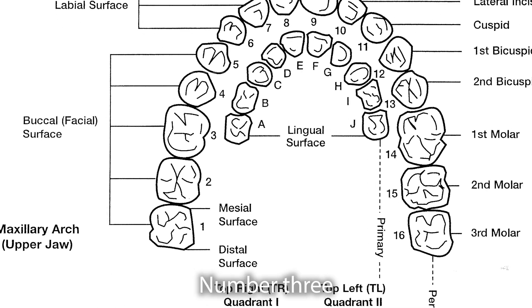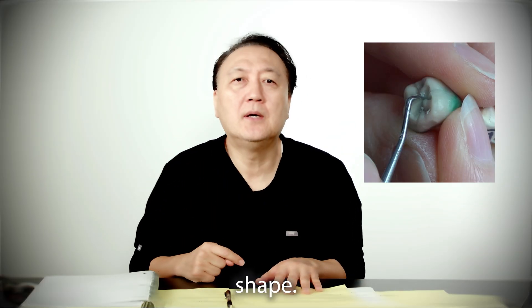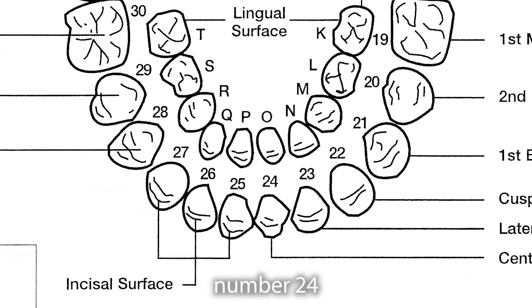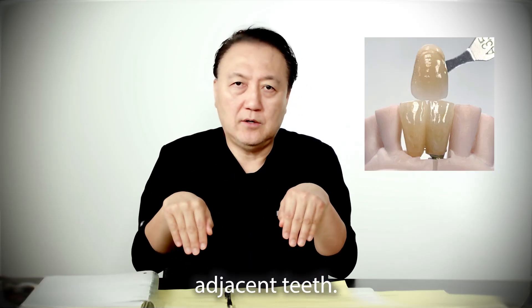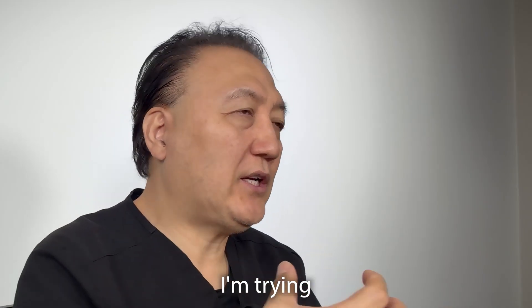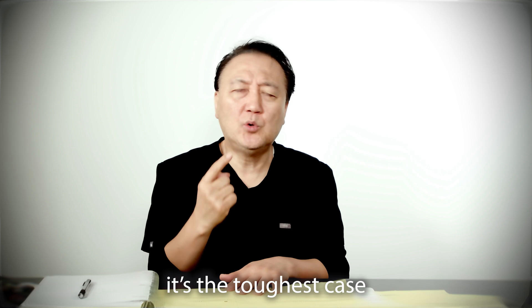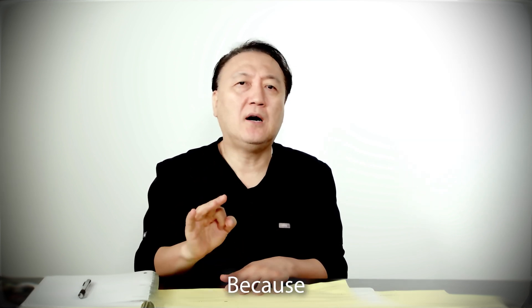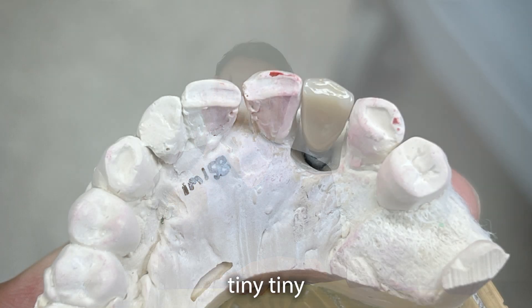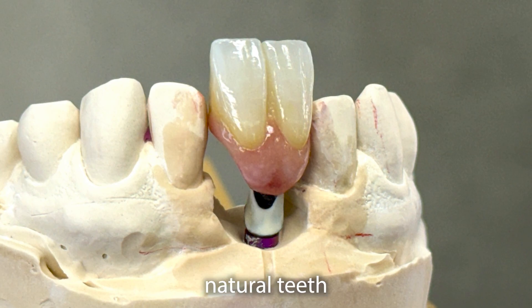What is this tooth number? Number three — upper molar — I have to make a rectangular shape. What about lower number 24? Make a very tiny one compared to adjacent teeth. I'm trying to get the right positioning. This area is very dangerous, very tough. To me, the most difficult case is the lower single central — because it's a tiny, tiny space with adjacent teeth and you're trying to match natural teeth harmony.